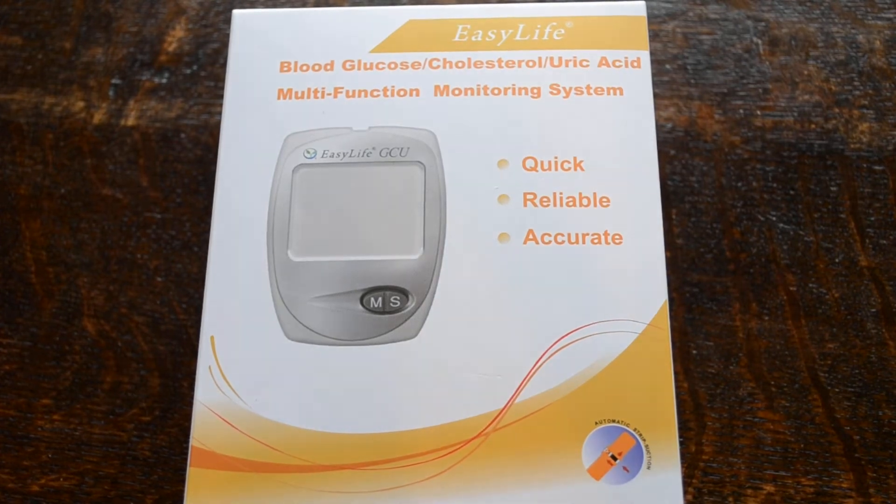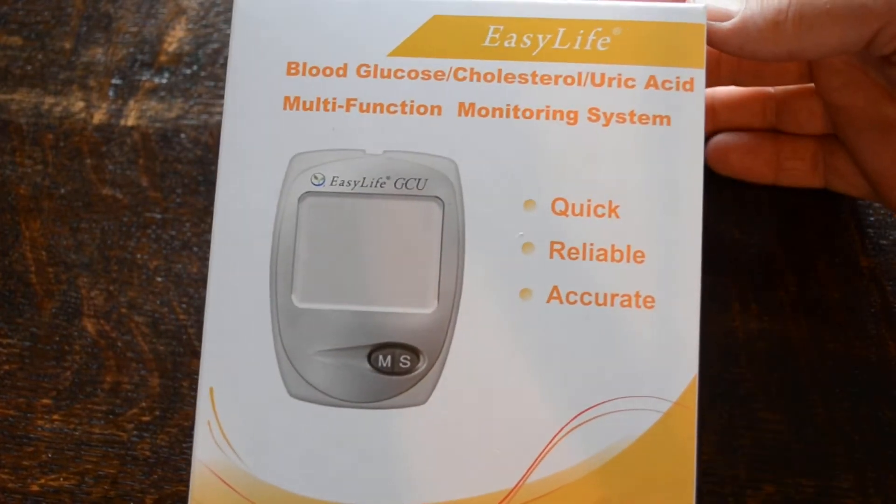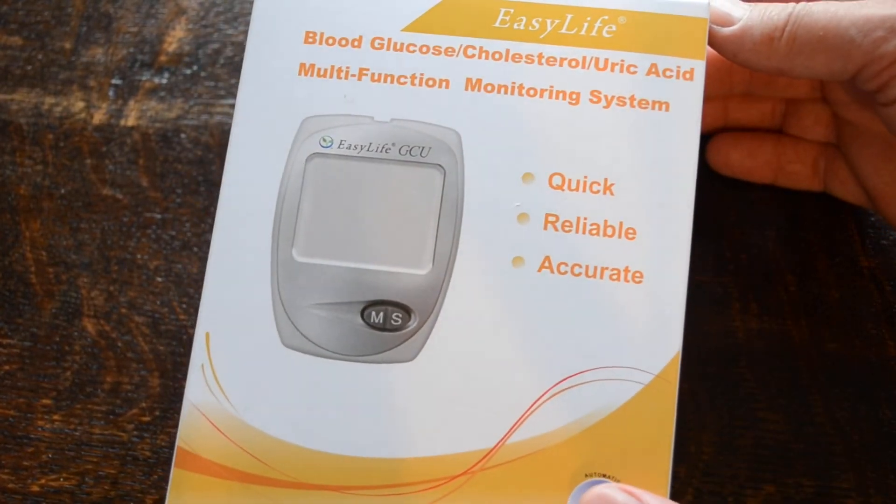This is the meter pack system that you get when you buy this system. It retails in the UK for around £40 plus delivery.